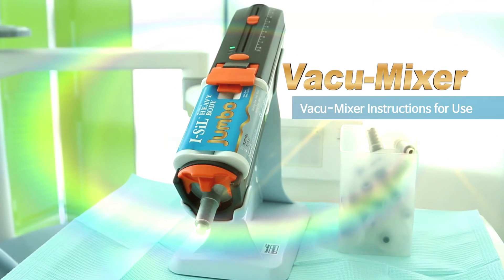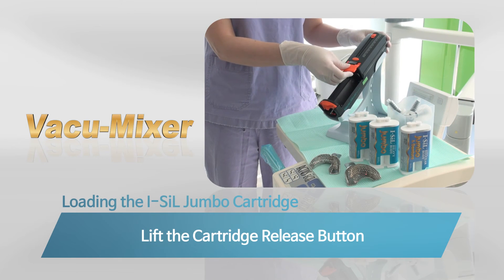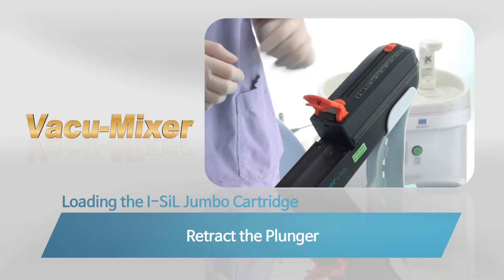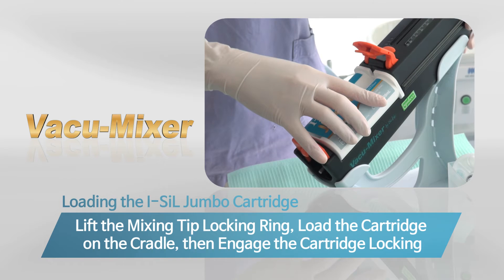Loading an impression cartridge in the Vacuum Mixer is similar to loading a standard extruder gun. First, lift the lock latch on top of the unit by hand. Next, retract the plunger all the way back, then lift the mixing tip locking ring.